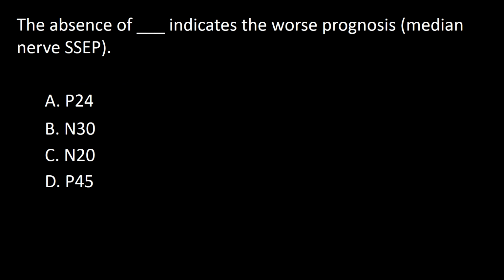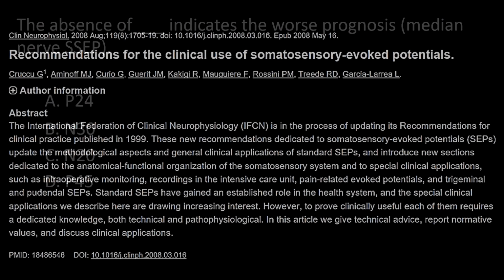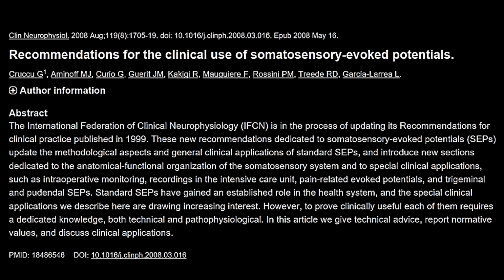Next question. The absence of dash indicates worse prognosis after a median nerve somatosensory evoked potential. A. P24, B. N30, C. N20, D. P45. This abstract belonged to a frequently quoted paper. This paper is about clinical application of standard somatosensory evoked potentials.